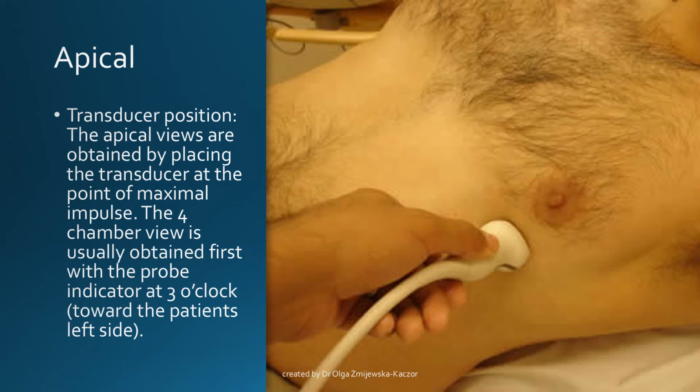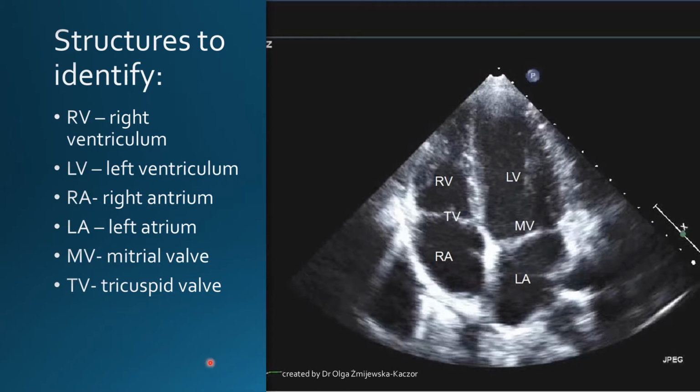Finally, the apical or four-chamber view. You can see the transducer is in the anterior axillary line with the notch pointed towards the patient's spleen. You start from the anterior axillary line, and then depending on the patient's body habitus, you may move it centrally. The structures you can identify in this view are the left ventricle, mitral valve, left atrium, right ventricle, tricuspid valve and the right atrium.